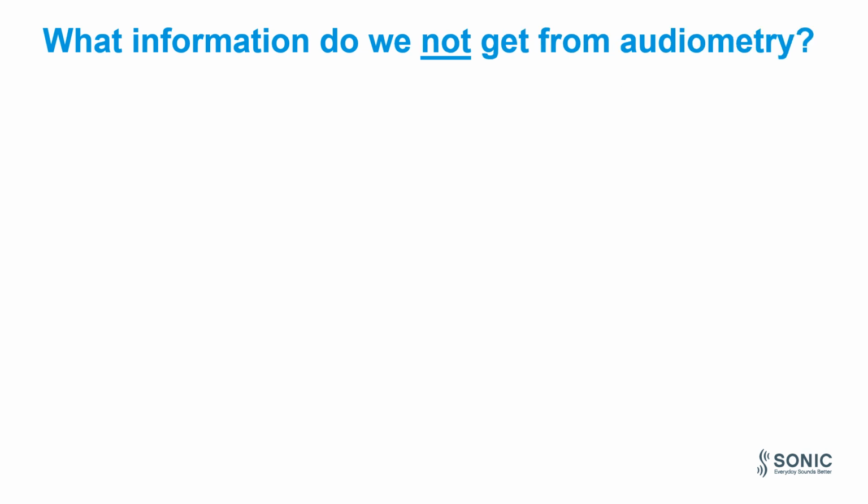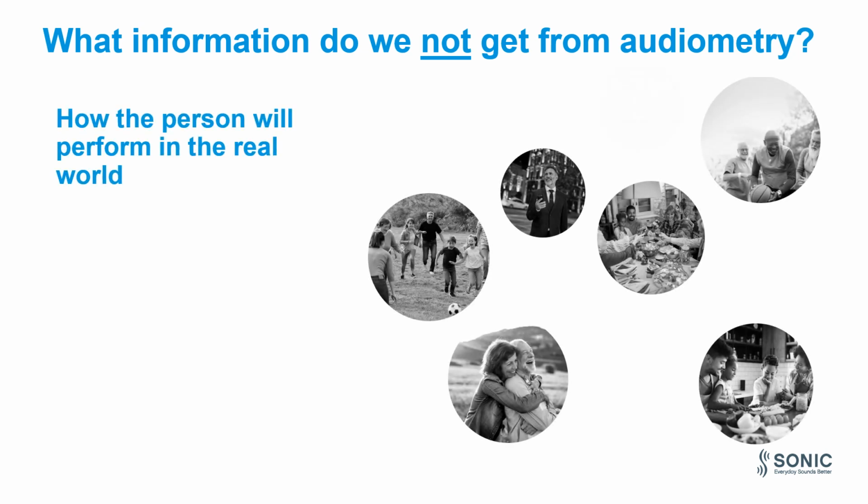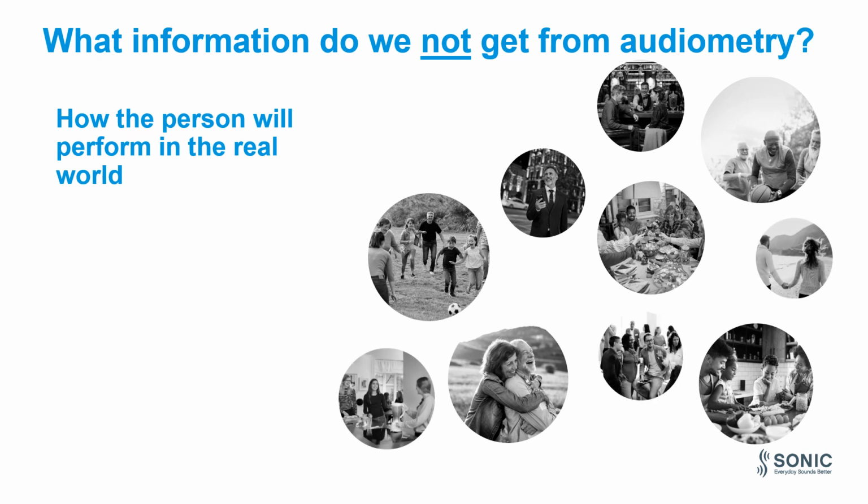Of course, audiometry is a very important test, but what information do we not get? What is still missing? The audiogram does not tell us how our client will perform in the real world. In the real world, we do not use pure tones or warble tones to communicate.